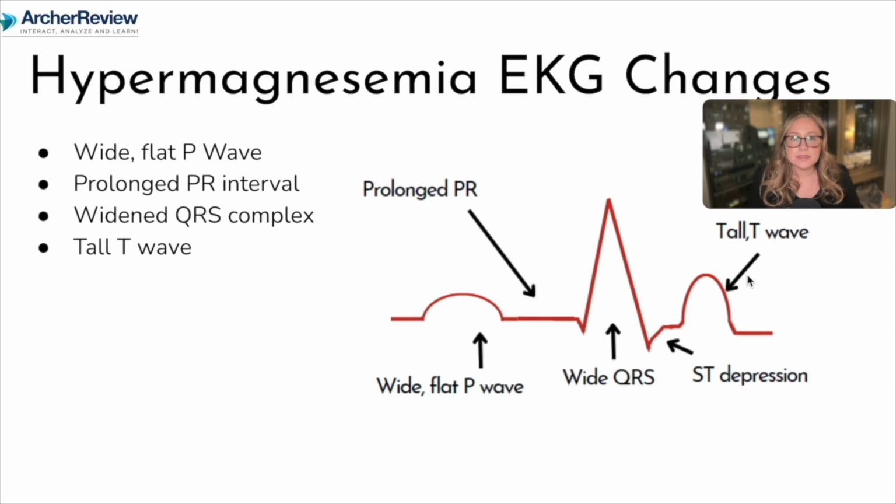Versus in hypermagnesemia, that's not our typical description. We just talk about a tall T wave. To be honest with you, this is really hard. In real life, if I start to see these EKG changes, I want to check my client's electrolytes to really figure out what's going on. I want to look at their potassium and their magnesium. So clinically, we're going to see some similarities here.